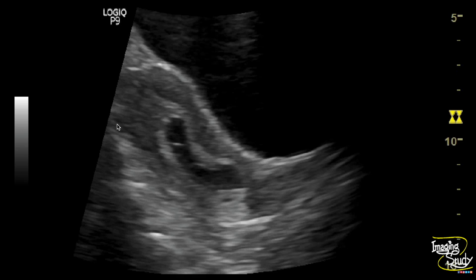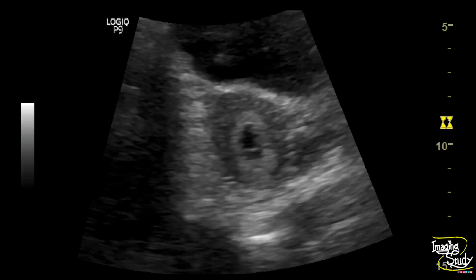Here is the longitudinal section, and you can see this irregular gestational sac with internal echoes but no yolk sac or embryo. And this is the transverse section — you can still see this irregularity.